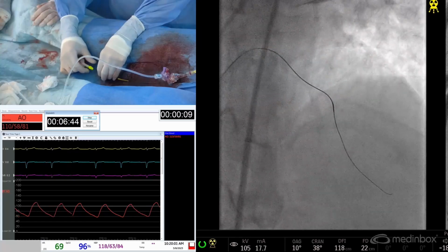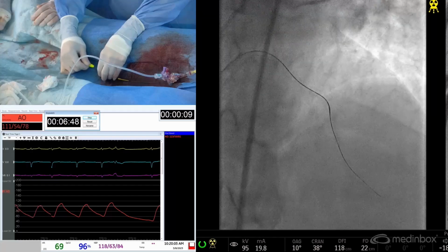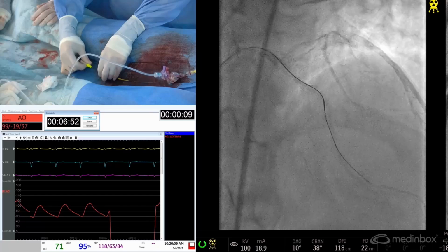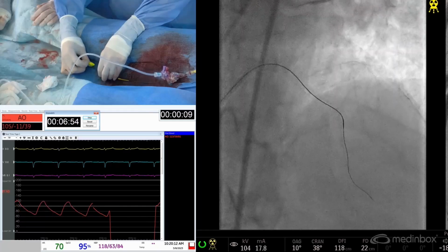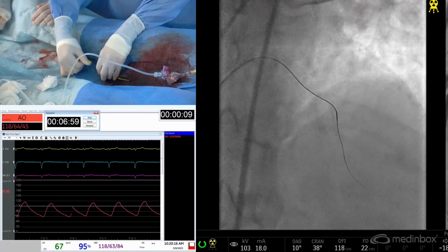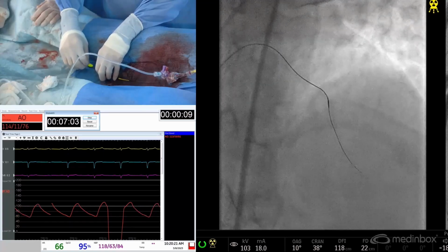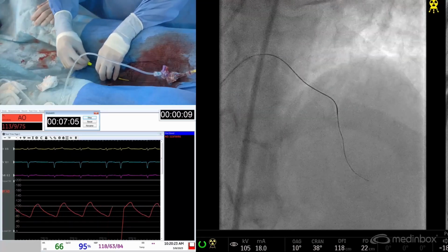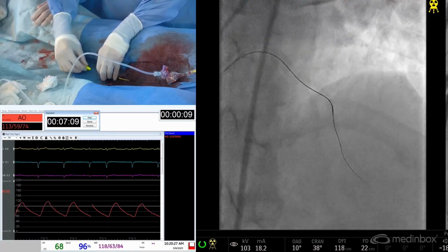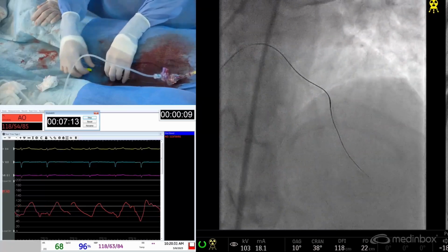This is a sort of slip and slide catheter, as operators know. Whereas the Corsair Pro XS is 2.3 French. Shall we swap it for the Corsair Pro X? Lower profile, and even though this profile is lower, we can't move forward with this.